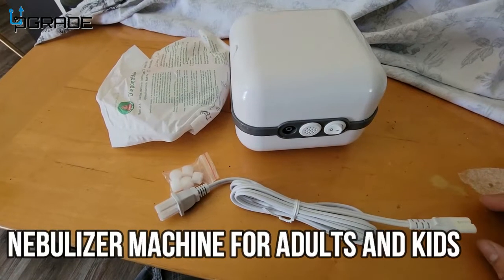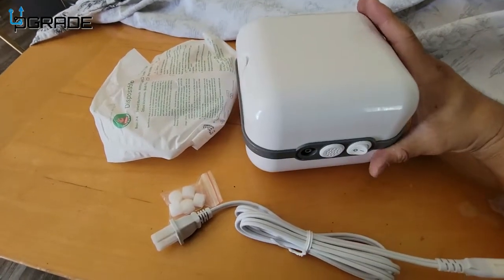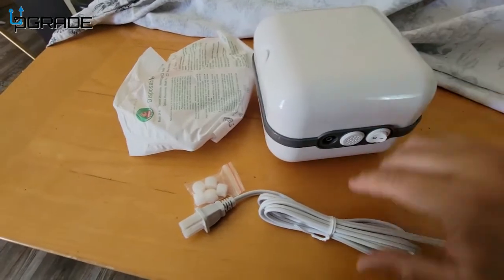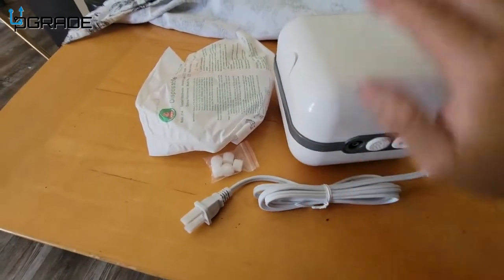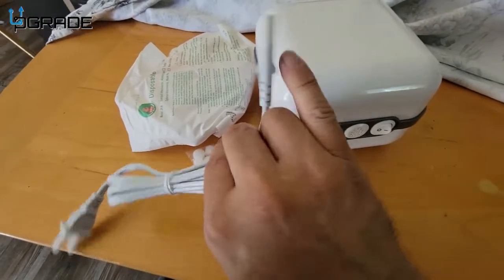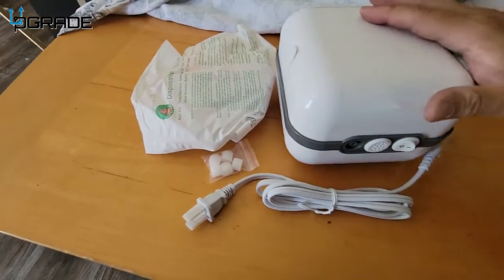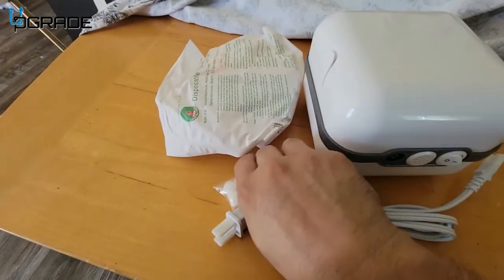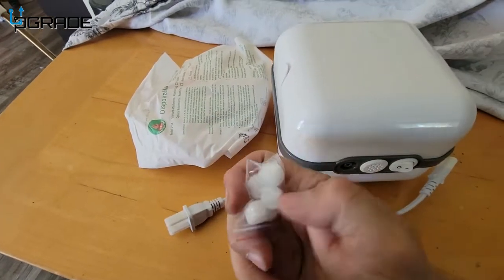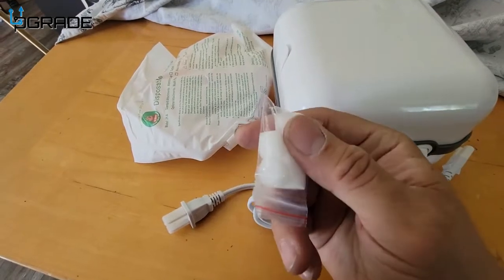Alright, today we're going to look at a compressor — especially if you suffer from asthma or are having issues breathing, this is going to help you out. It's for personal use or indoors, or you can take it with you on the road. It does require a two-point connection to get power. It comes with the actual compressor system itself, an on/off button, and they give you filters — these filters are very important.